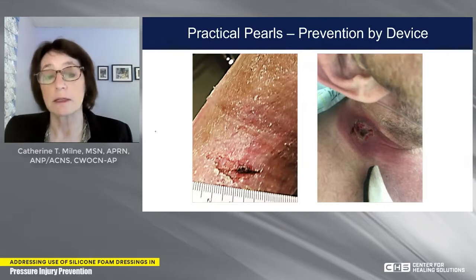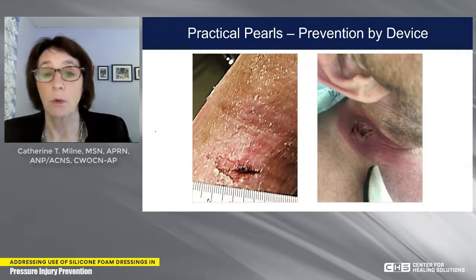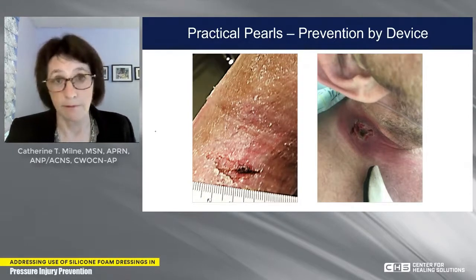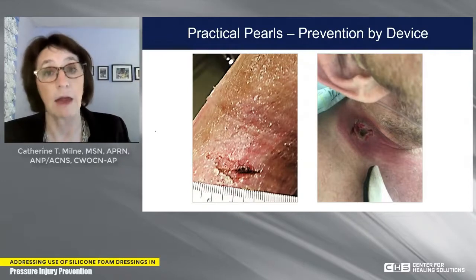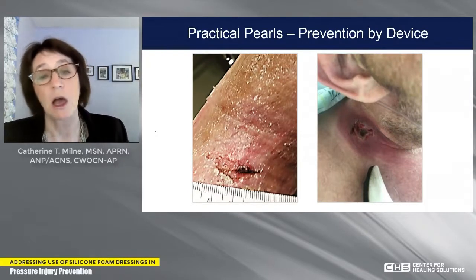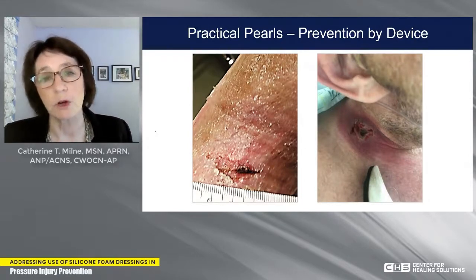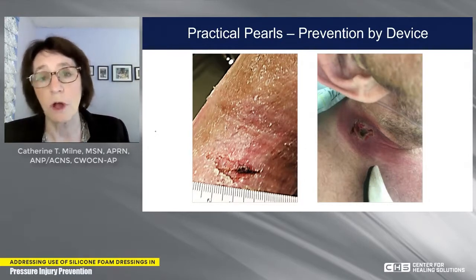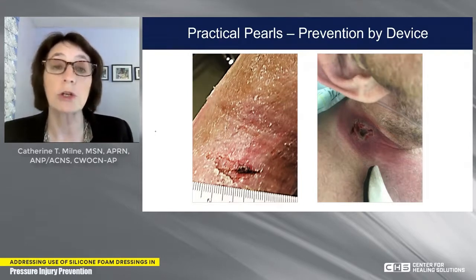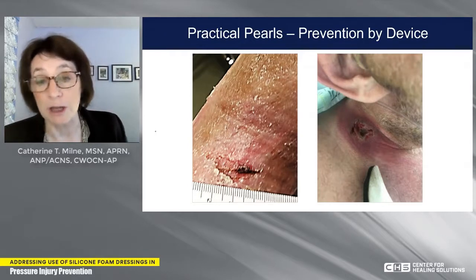Over on the right, this is a cervical collar. We know that a lot of our patients during COVID got hypoxic. Many of them fell in long-term care, and some of them had adverse events from those falls. This is one of those patients. A lot of the times, especially under cervical collars, they're hard to move. We can't move them. We're very concerned that we may do more neurological damage.